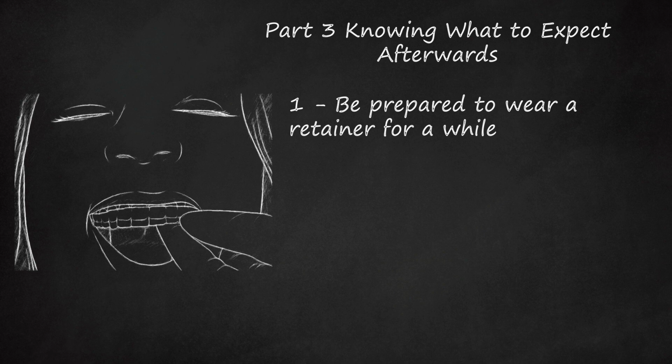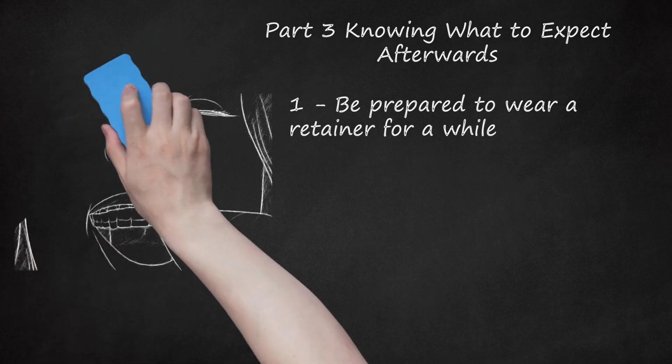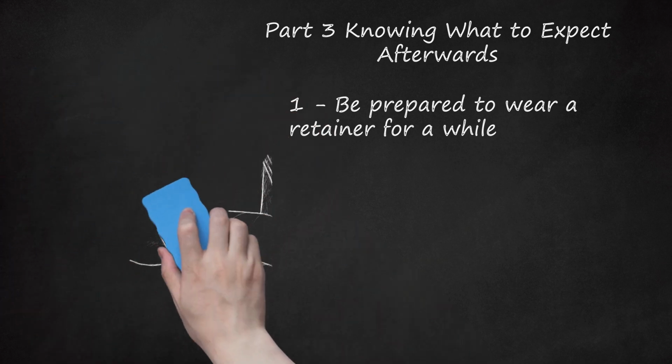You will need to take good care of your retainer. This involves cleaning it properly and not losing it. Make sure you wear the retainer as advised, or you could undo all your good work.